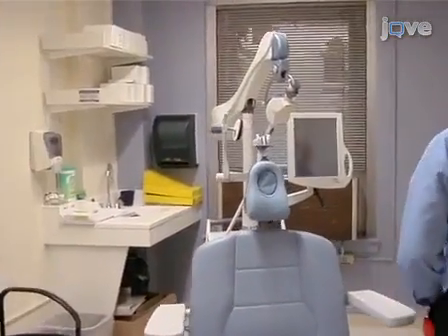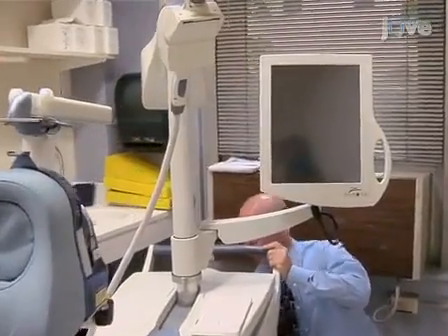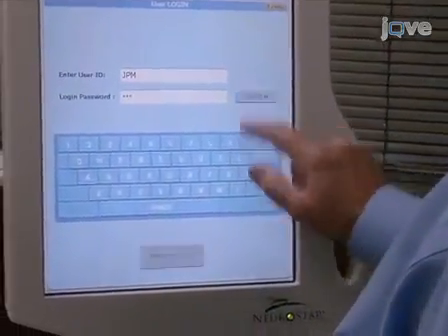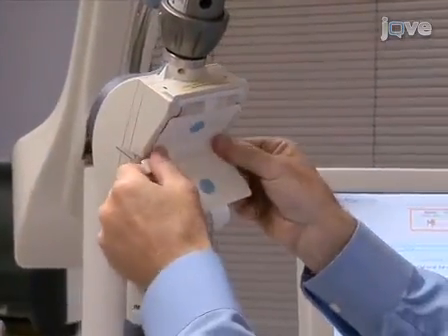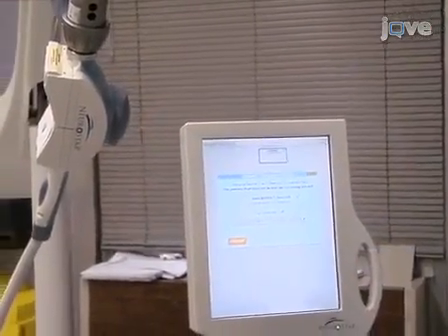Begin preparation for the session before the patient arrives for treatment by first turning on the NeuroStar system. Then, use the touchscreen display to log in at the prompt. Also attach the SendStar treatment link to the stimulation coil and perform the automated coil test.